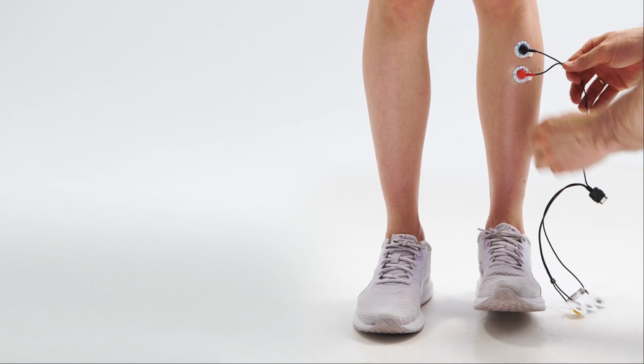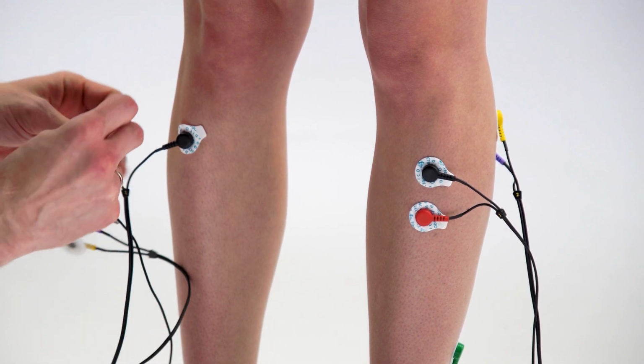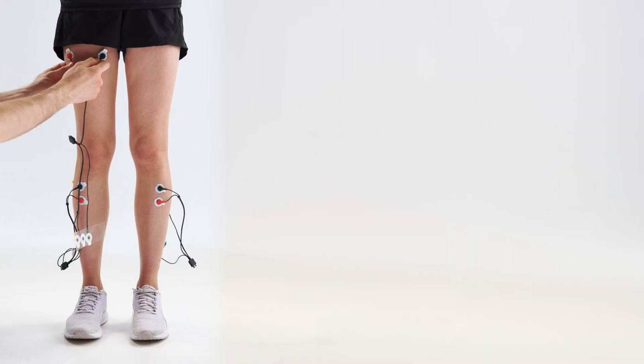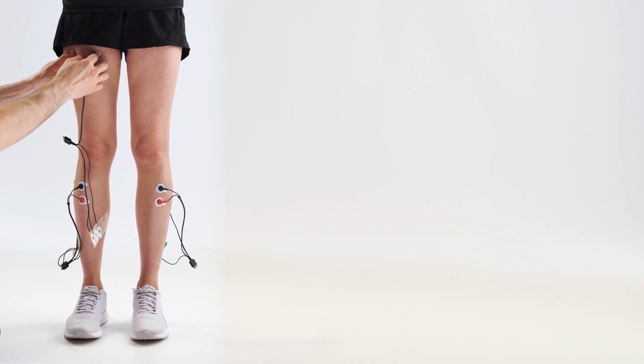To perform a gait biomechanics study, first of all, we install EMG electrodes on selected muscles. At the level of the calf, these are the gastrocnemius lateralis, tibialis anterior, quadriceps femoris, and the biceps femoris muscle at the level of the thigh.